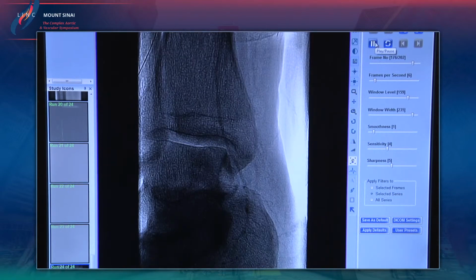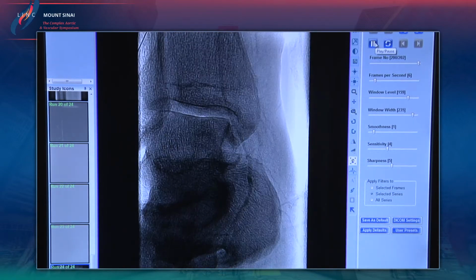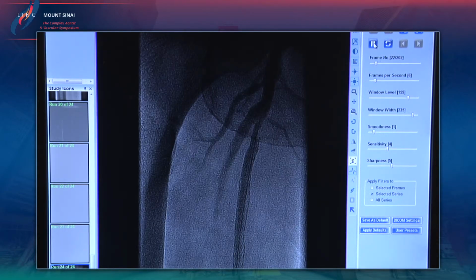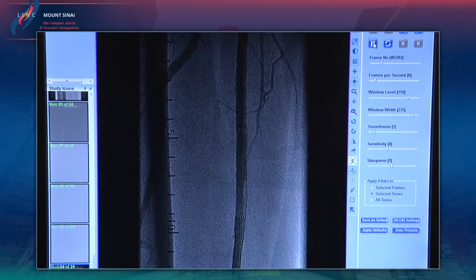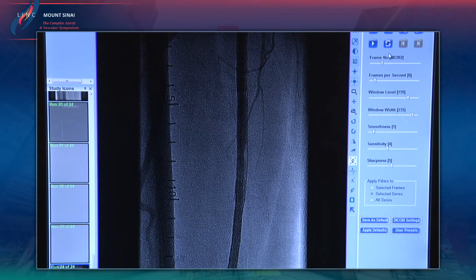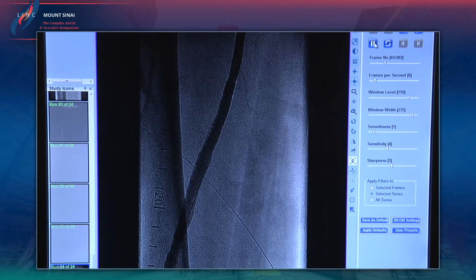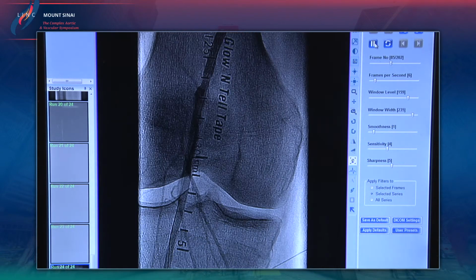So we did not balloon angioplasty that spot. You'll see it in the next runoff. Rather, we decided to put the patient on anticoagulation and then followed by ultrasound right at that spot. So it wasn't free moving, and we felt that if we had angioplasty, we would have sent it distal and made this patient worse. But from no flow to now, very good flow, and I'm sure good relief of symptoms.